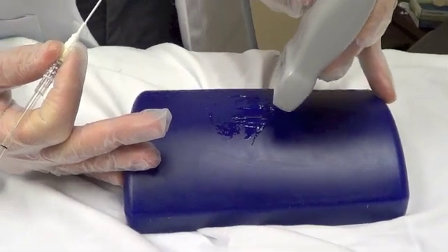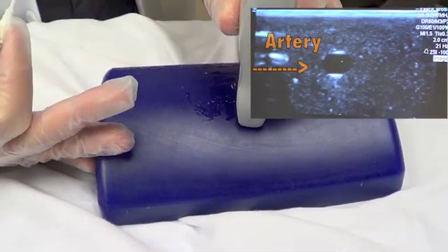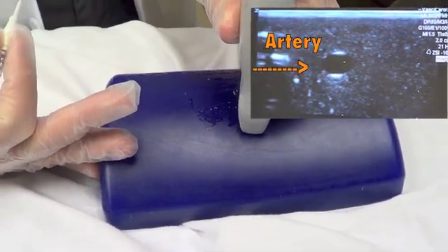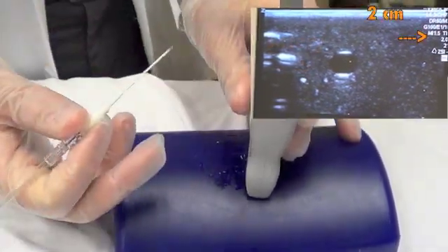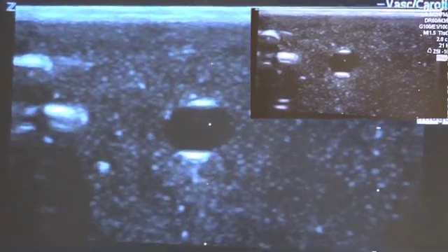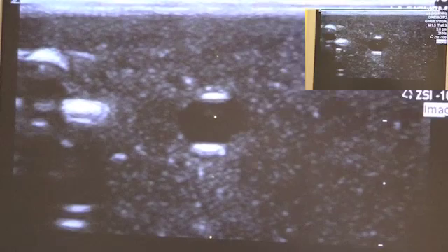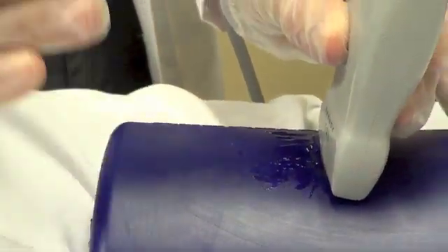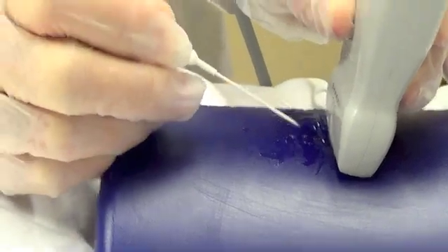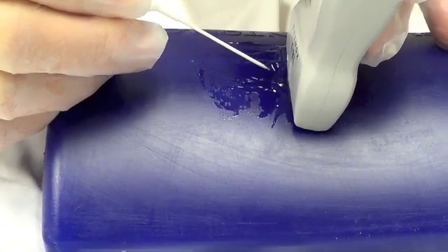I'm going to take the probe and find my radial artery — and I find it right away. As you can see on the ultrasound screen, the depth is currently set at two centimeters. You can adjust the depth as needed depending on how much subcutaneous tissue the patient has, up to about three to four centimeters. The artery is pretty much directly halfway in the screen, meaning it's one centimeter underneath. I'm going to enter the skin about one centimeter distal to the edge of the probe, directly in the center of the probe.